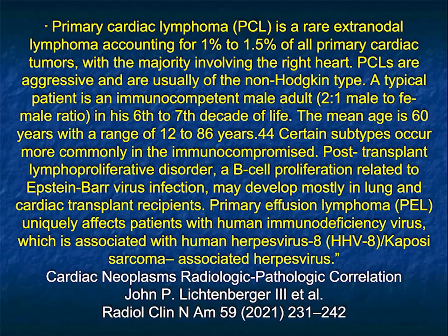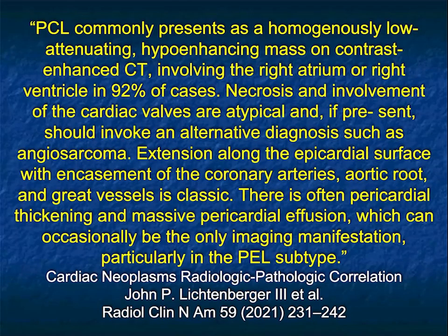Again, one of the things I've noticed, and I'll show you some examples, it may not be the only finding. It's interesting, a couple of cases I'll show you, the patients present with shortness of breath or chest pain. You find the cardiac lesion, you also find an extracardiac lesion. Then you put 2 and 2 together and you could reach the diagnosis.